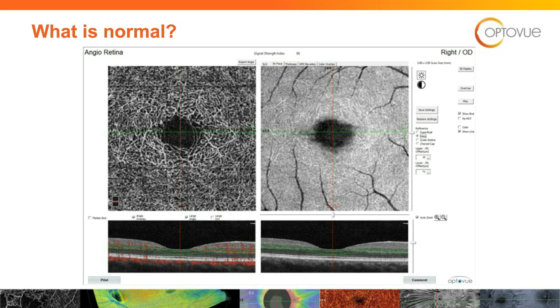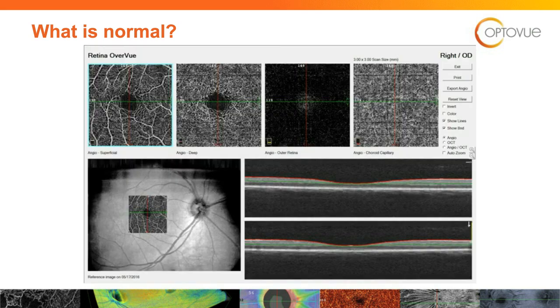So that is an interpretation going through your slabs. Once again, here's the overview slide of what is a very, very normal and healthy 25, 26-year-old optometry student. No pathology here. This looks great. The two scans on the left, the FAZ is of appropriate size. We have no capillary remodeling, no capillary dropout, no areas of non-perfusion. This vessel density looks very, very good in this scan right here.